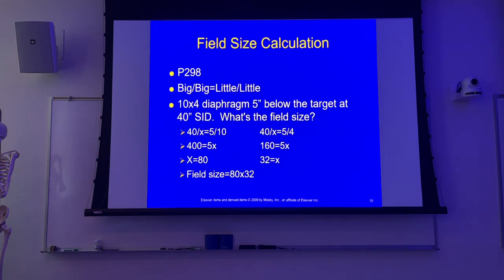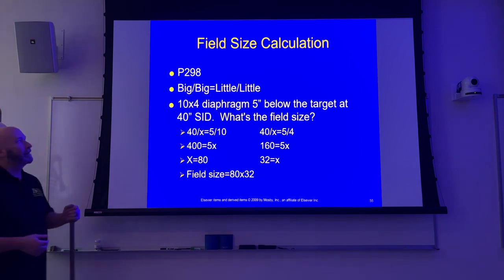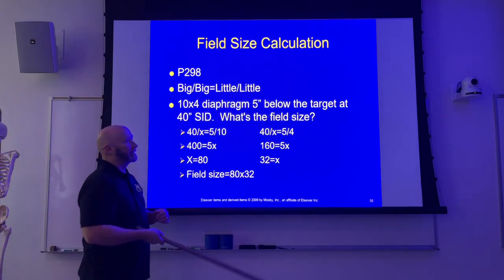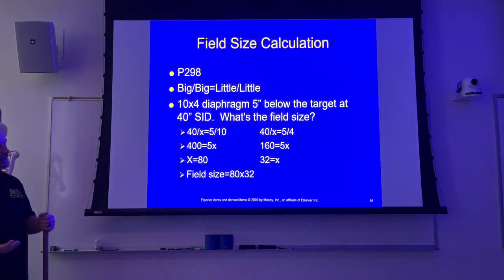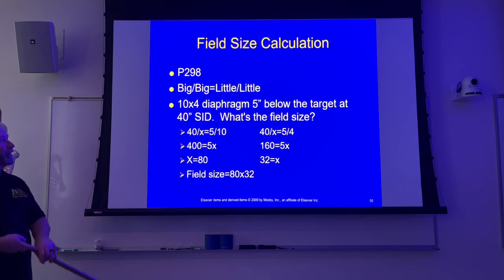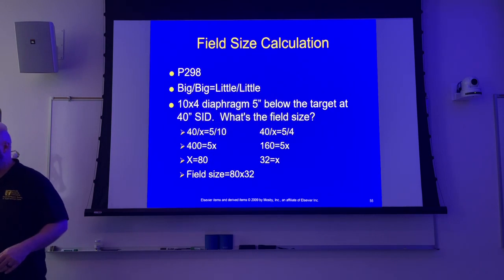So I did not bring my textbook, so we're not really going to run through this all that much, but you are going to have to know how to calculate field size. We'll cover this in class on Friday of next week and actually do the math, but the formula in the textbook is a little bit more complicated, harder to remember than the way I have it set up here. So I'll just draw it out.